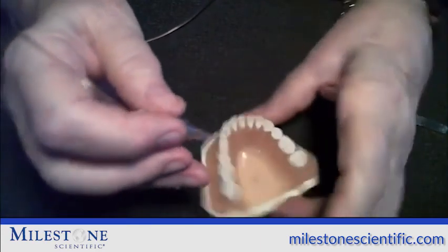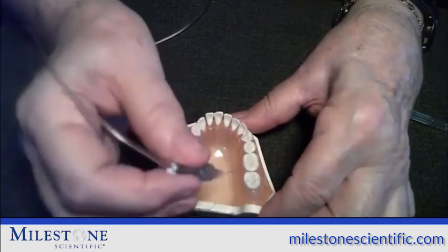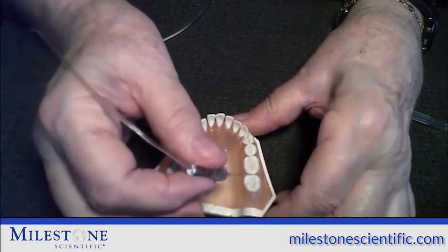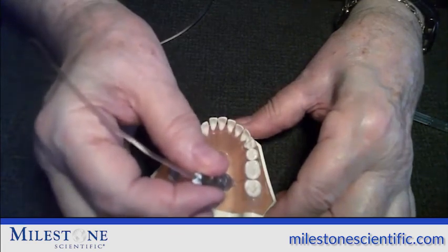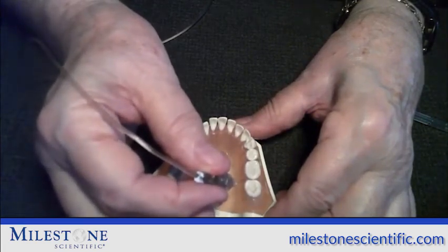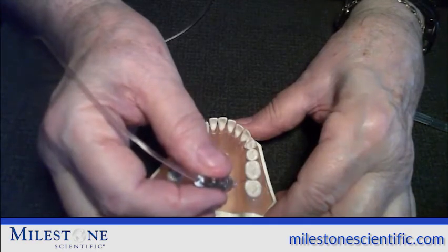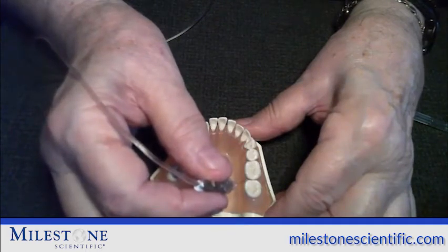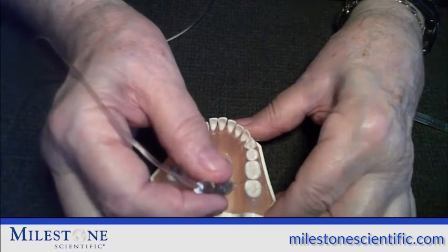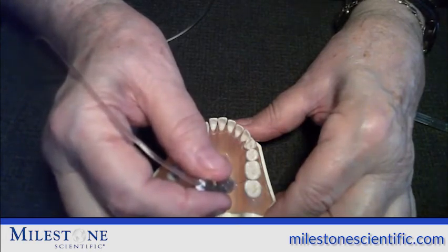To numb a lower first molar, hold the instrument very, very lightly like a pen grasp. Approach the tooth at a 45-degree angle from the distal, going across the tooth so the flow is going diagonally across the tooth. Hold it lightly, start the flow of anesthetic, and move the needle down until you reach resistance. Then after 10 seconds or more, you're going to hear the lights and sounds of the DPS come on. Hold the needle lightly — do not put pressure on the needle trying to make the lights go past yellow or red, and do not push to get to green, as that is probably blocking the flow of anesthetic so it does not drip into the bone.